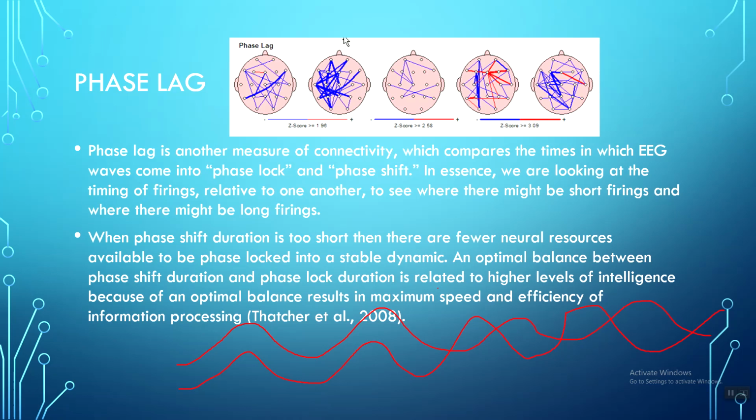Is it possible to have a lot of phase lag, but also have a lot of coherence, where the brain is just locked in a pattern where they're not cohering with each other, but still having that cosine sine kind of relationship? Or is that just not possible?